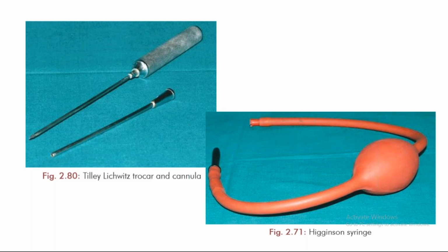At the end, flush around 20 to 30 cc of air so that the remaining saline comes out, and the maxillary sinus is free of pus or fluid.